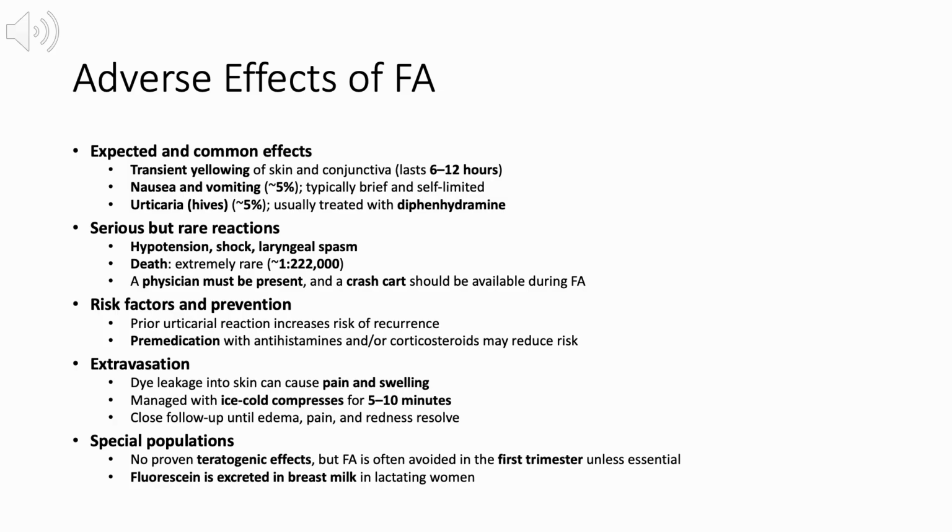More serious reactions are rare but clinically significant. These include hypotension, shock, and laryngeal spasm. Death is extremely rare, with an estimated incidence of approximately 1 in 222,000. For this reason, a physician must be present during fluorescein angiography, and a crash cart should be readily available.